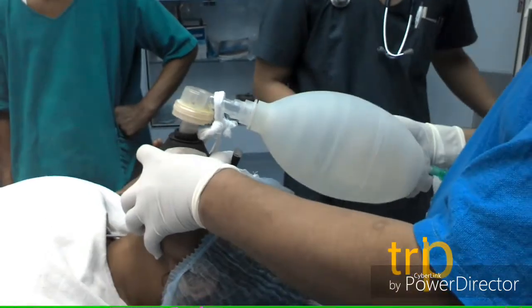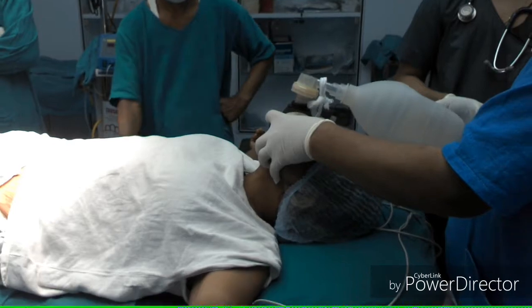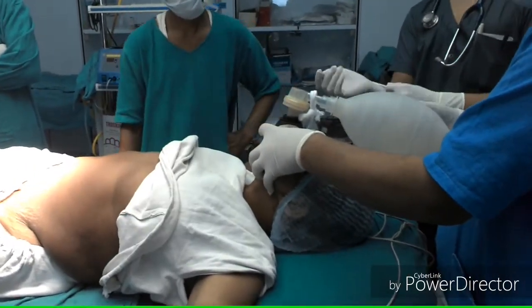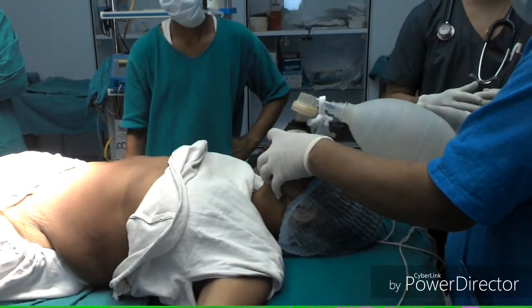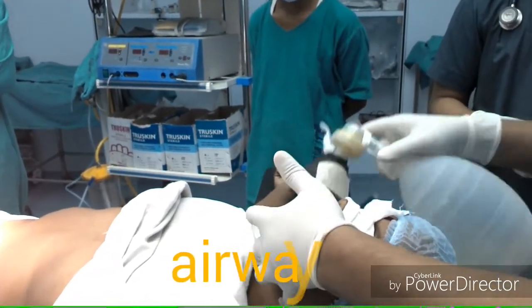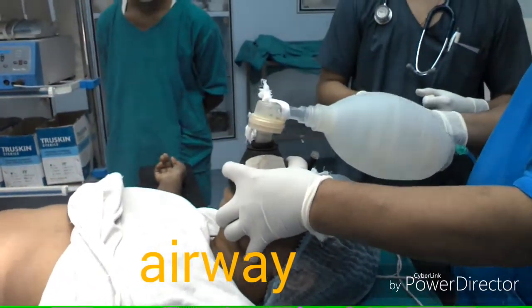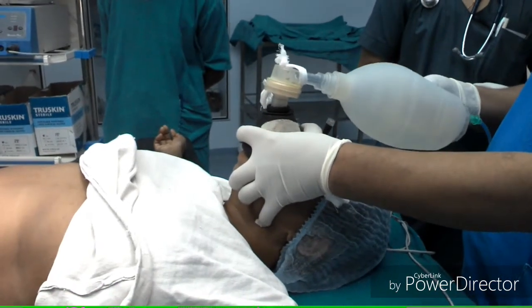During resuscitation, when the patient is unconscious, the tongue falls back and obstructs the air passage. Positive pressure ventilation is not possible in this condition. So, to correct it, partially open the mouth, dislocate the TM joint and push the mandible anteriorly. It opens up the respiratory passage. Putting in an airway helps further.